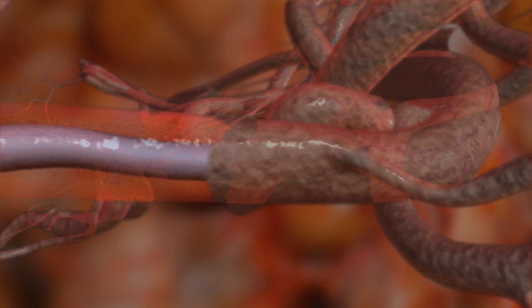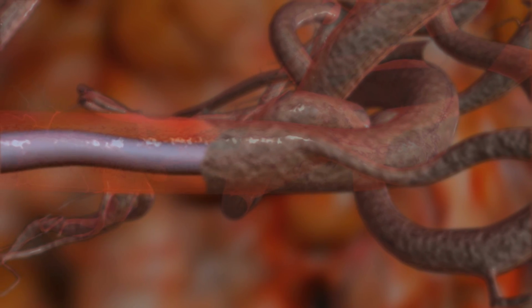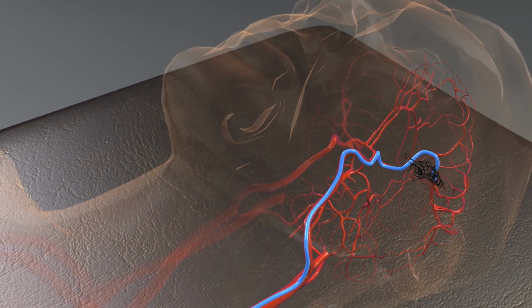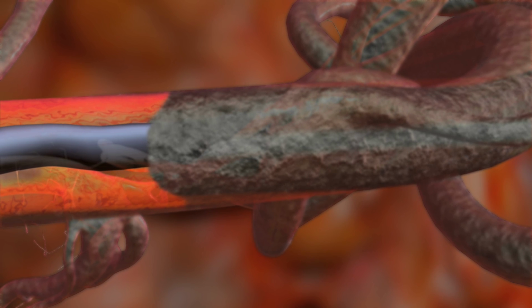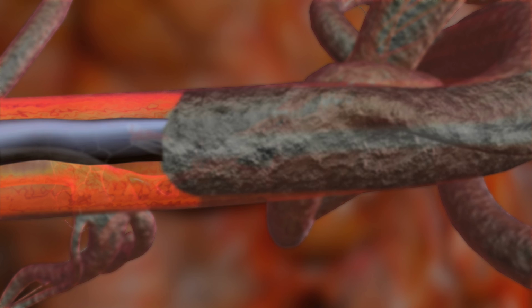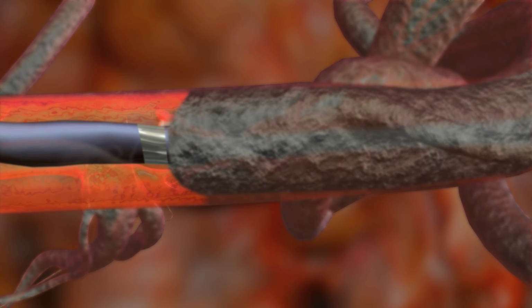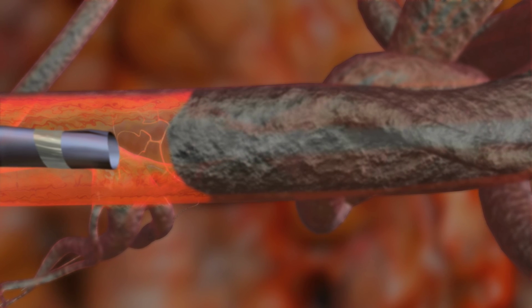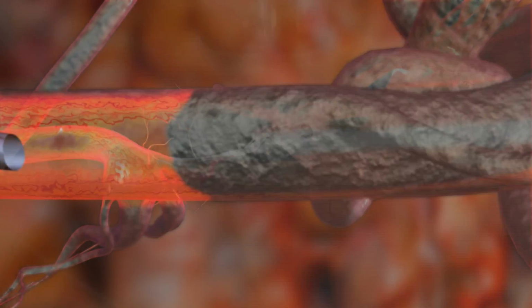Stop the injection if ONYX is not visualized exiting the catheter tip or if increased resistance is observed. Once a predetermined amount of the nidus has been embolized, aspirate the syringe by 0.1 milliliters. Slowly remove the slack from the microcatheter and maintain gentle traction. ONYX is cohesive, not adhesive, so the microcatheter should slowly slide out of the ONYX cast. Once the catheter is free of the cast, it can be removed from the vasculature. In the event of difficulty removing the catheter, refer to the instructions for use.